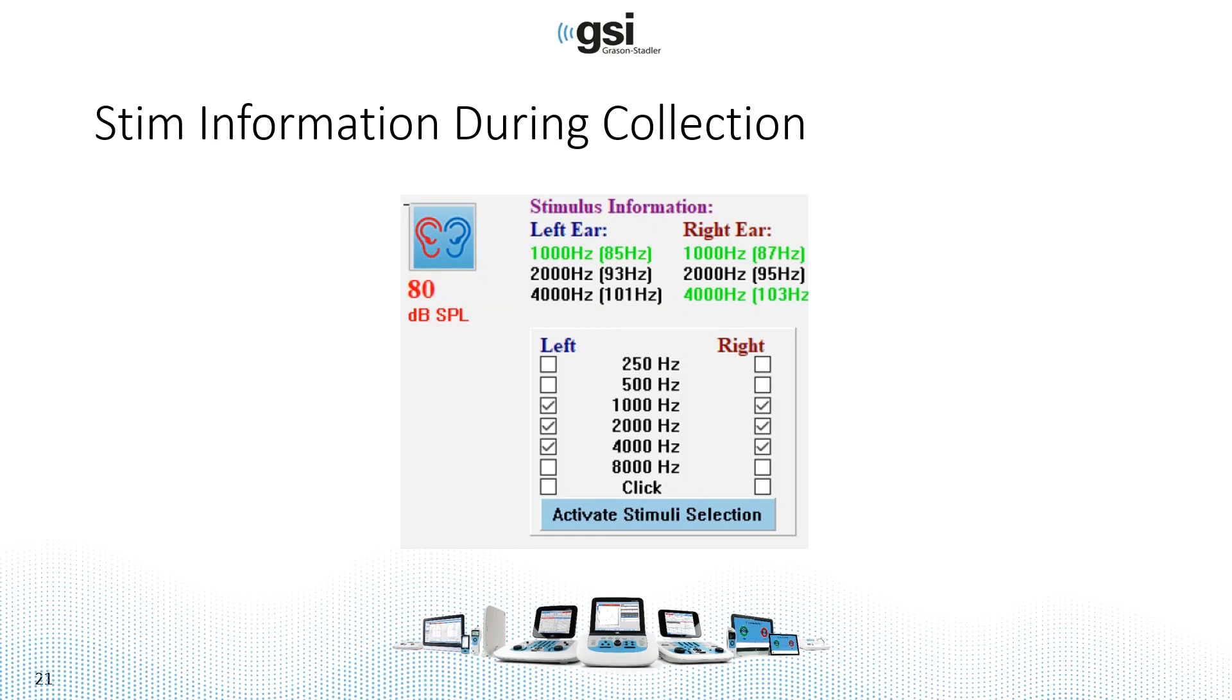During collection, they will turn bright green when a significant response is detected. So you can see here that 1,000 in both ears, 4,000 in the right ear indicates that there is a response, because it's in bright green. This is the same color that will appear in the polar plot. So you can monitor this screen as you are collecting.